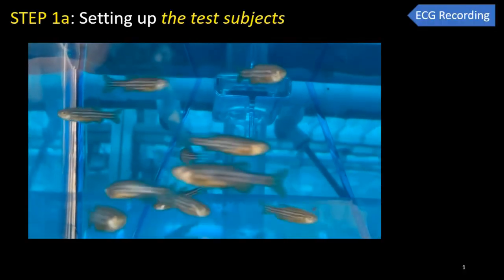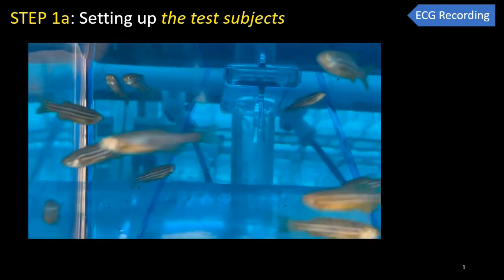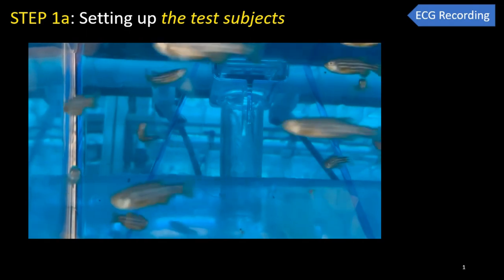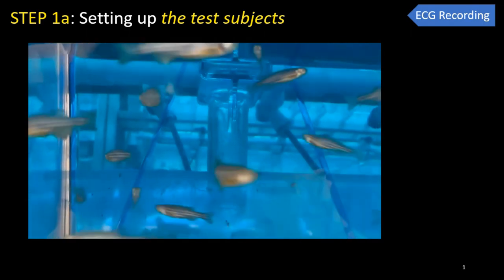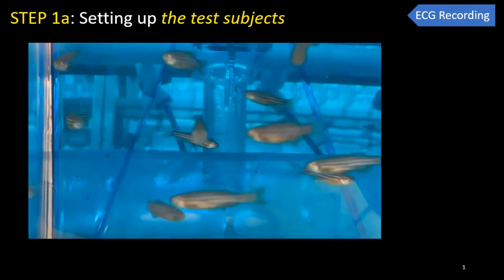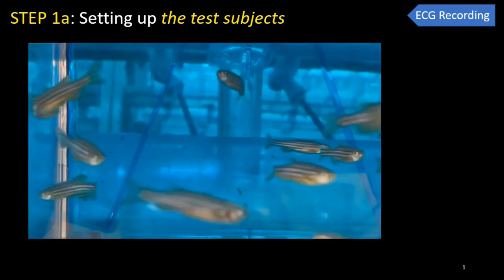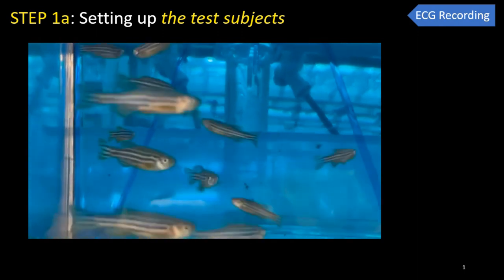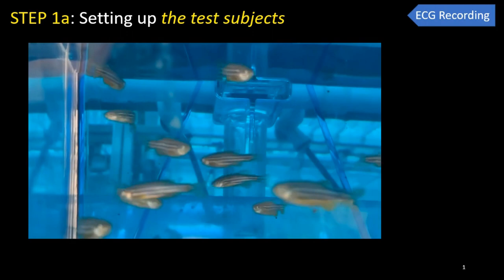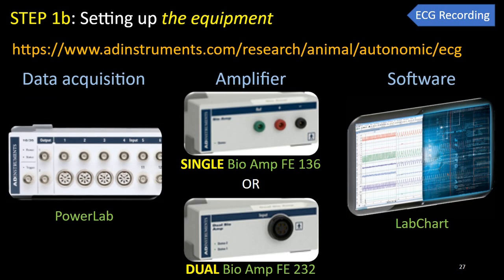Our lab uses zebrafish from the UCLA core facility. The fish there are maintained in flow-through aquarium systems on a 14-hour light, 10-hour dark cycle at 28 degrees C. They are fed with flake food daily and live brine shrimp twice daily. On the day of the experiment, we bring the fish from the aquarium to the lab. We also obtain all the necessary accessories, importantly, a wet sponge with slit to hold the fish during ECG recording.